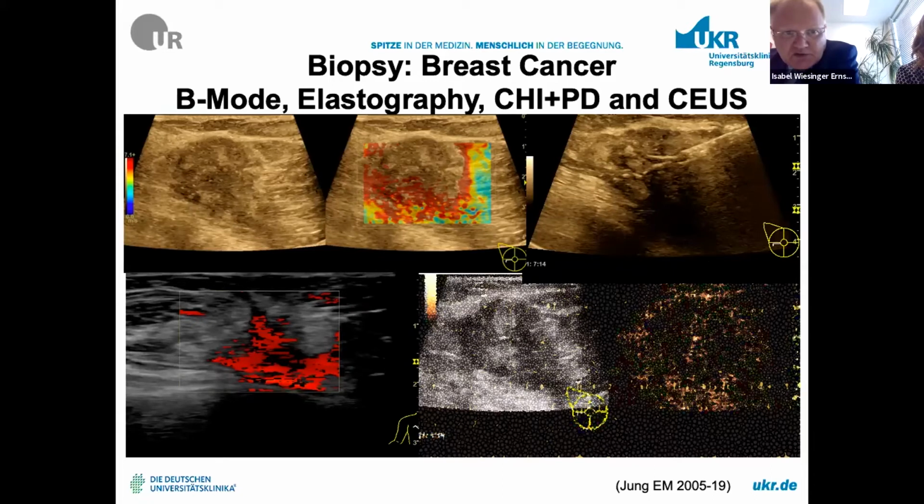You could use contrast enhanced power Doppler for the neovascularization, but you need high resolution contrast enhanced ultrasound for a clear decision about which part of the tumor has necrosis or not, and what the real margins of the tumor are. You have to perform biopsies at the part where you have the clear, irregular neovascularization in cases of malignant tumors.